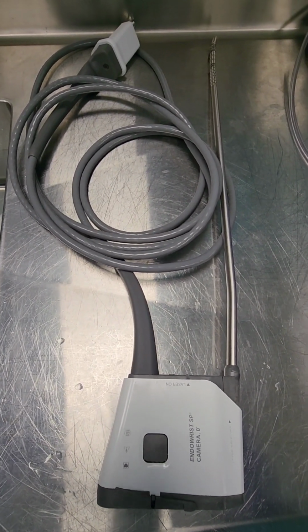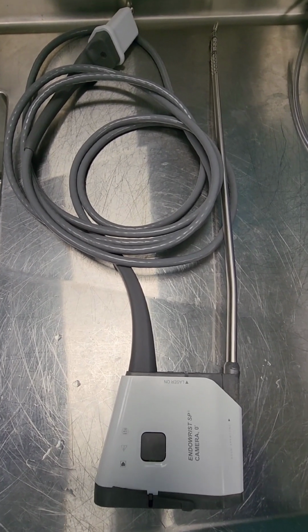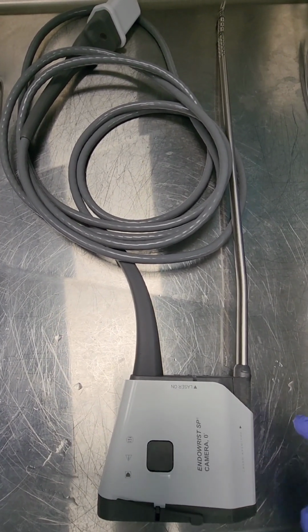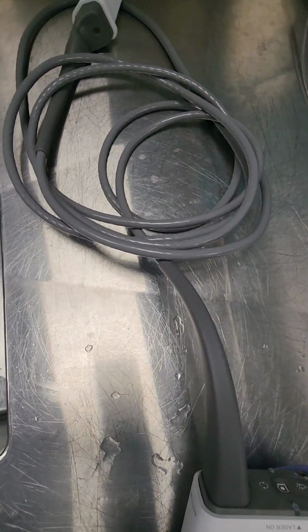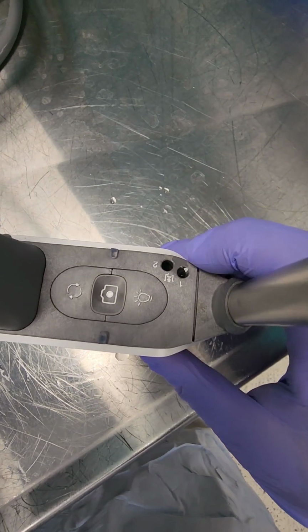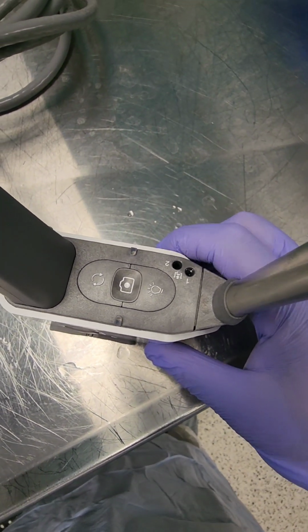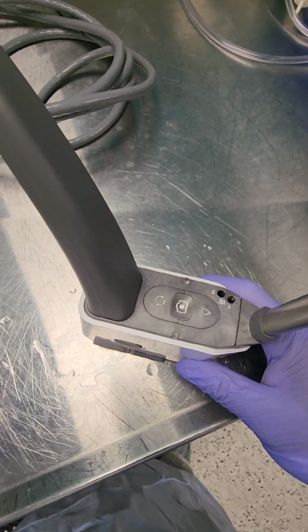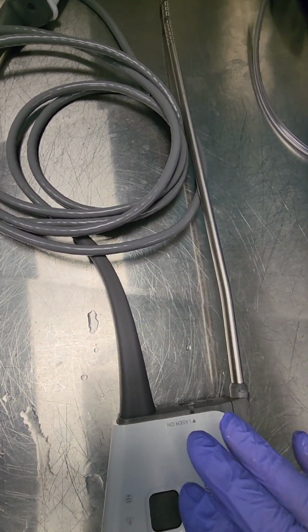The only difference with the camera is that you have certain steps you have to do when you're soaking for that 30 minutes. And actually, it's a 31-minute soak. So you're going to soak for 24 minutes, and then you're going to go ahead and wipe the distal tip of the device, right? So there's your flush ports prior to soaking. You want to make sure that you inspect your instrument for any damage prior to soaking.